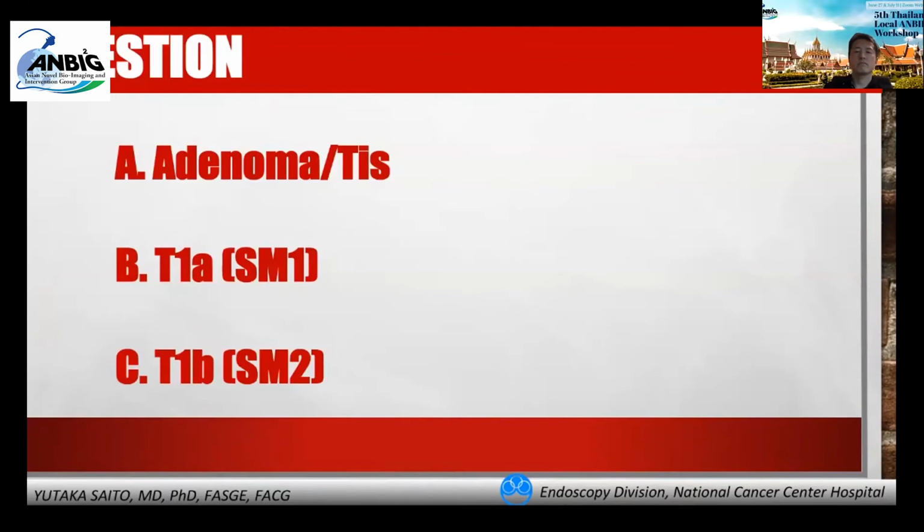Professor Yutaka, to be honest, I did the ESD for this kind of lesion yesterday. Oh, really? The same one? Yes, but in the middle of the lesion it was invasive, so I stopped the ESD procedure. I choose C. Could you observe the cancer invasion during the ESD procedure? Yes. In the center of the lesion is the invasive plane. I cannot see the plane to cut it off. I tried to cut it off, and then I felt that I was cutting into the tumor. So I stopped it. Better to go for surgery. Okay, more than half diagnosed SM2. Please go to the next slide.